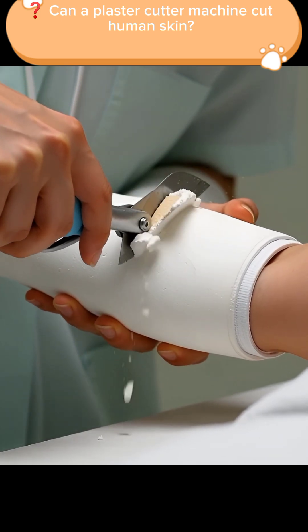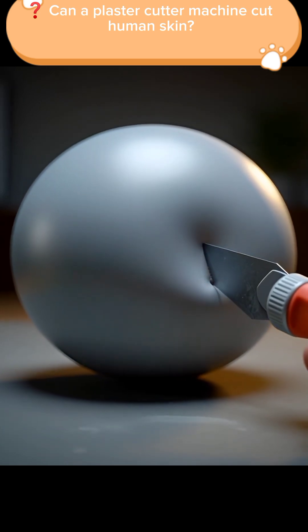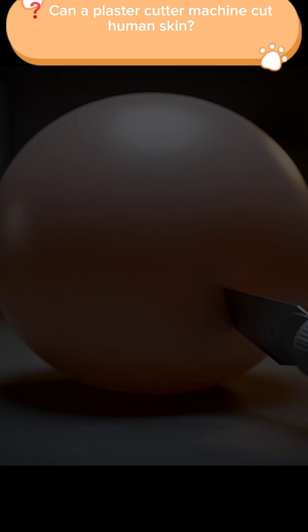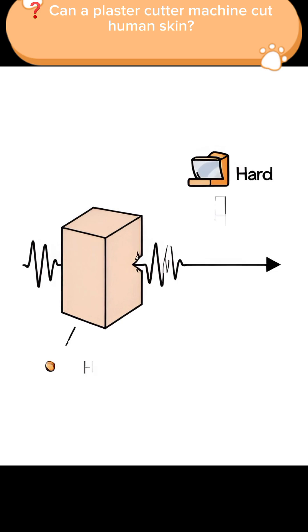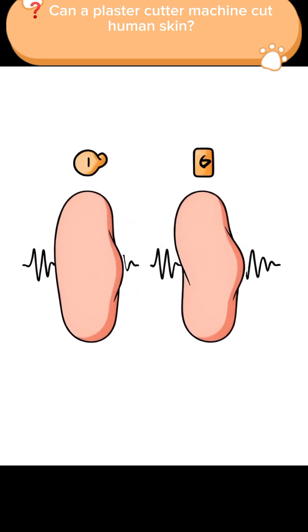And here's the interesting part. If you run this cutter over something soft and flexible, like a balloon, the balloon doesn't pop. Why? Because the soft material moves along with the vibration instead of resisting it. Your skin works the same way. When the vibrating blade touches your skin, the skin vibrates with it. So there is no cutting and no damage at all.